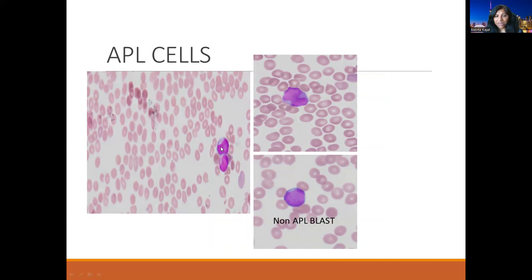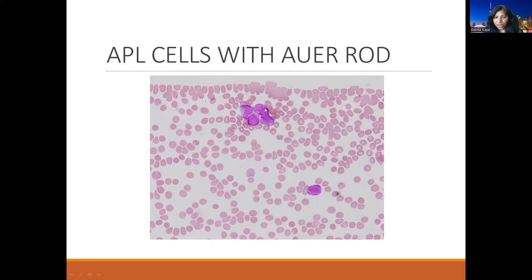Very rarely, we see pancytopenia and these kind of abnormal-looking cells. Here we can see a reniform, folded nucleus with high N:C ratio and big prominent nucleoli. This is also a dumbbell-shaped nucleus. These are APL cells — acute promyelocytic leukemia. This is again a critical value because these patients can develop DIC very quickly, so the clinician needs to be informed as soon as possible. Compared to these APL blasts, a non-APL blast doesn't have a reniform nucleus but does have a central nucleolus and high N:C ratio.